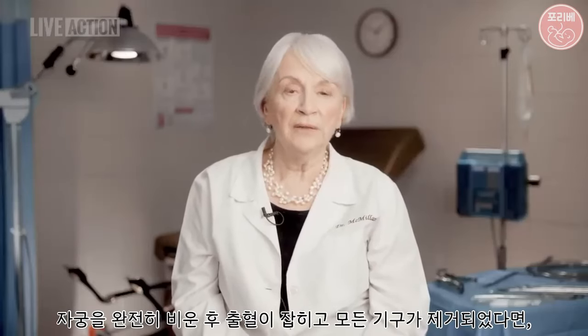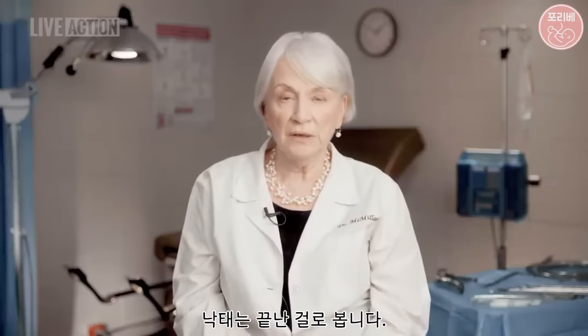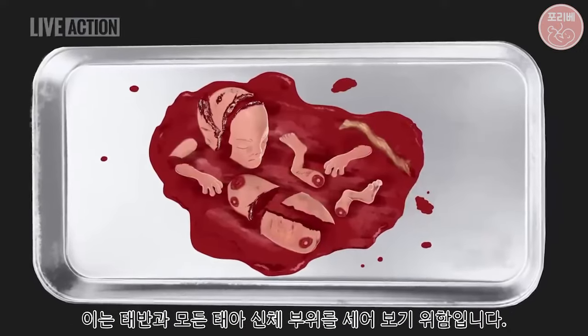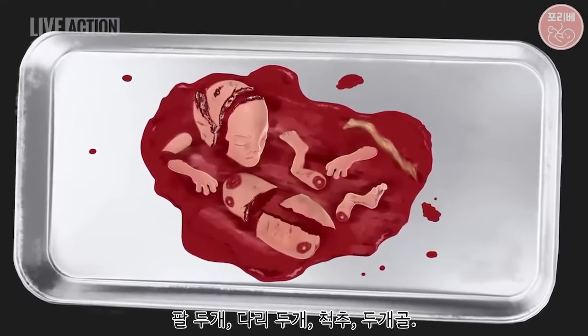Once the uterus is empty and the bleeding is under control and all the instruments are removed, the abortion is considered complete. But before the patient leaves, the tissue must be examined to make sure the placenta and all the body parts are accounted for. Two arms, two legs, a spine, a skull.